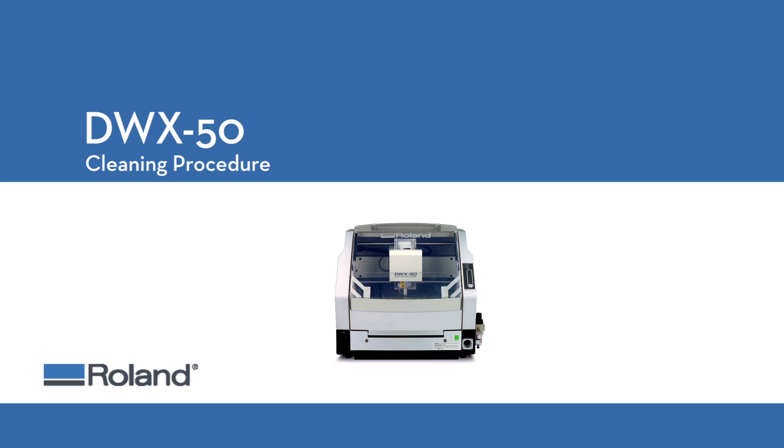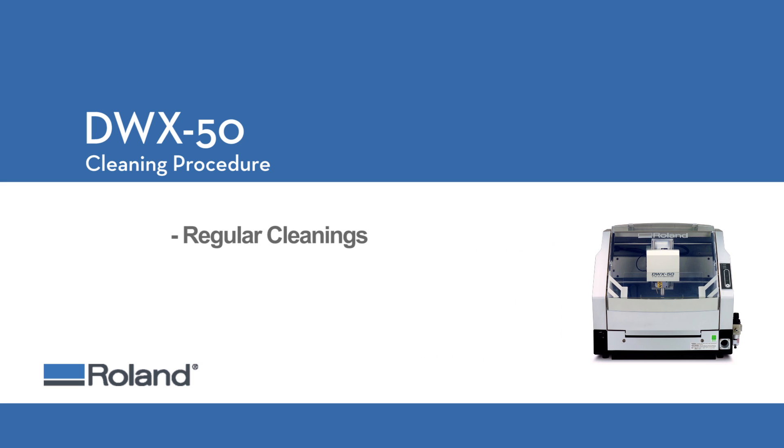When the Roland DWX50 finishes a milling job, there is usually some chips and dust left over that needs to be cleaned up. This video will assist DWX50 users in properly cleaning their mills, not only on a regular basis, but will also walk them through the best practices for cleaning and preparing the mill for calibration.